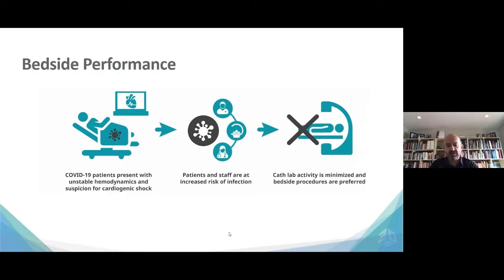And again, those of you who've seen these COVID patients, they're pretty sick. You know, they are on very high ventilator settings. Frequently, they're on dialysis. So again, this brings back this procedure at bedside, which we almost stopped doing, I guess, maybe 15 or 20 years ago. So again, this is a good opportunity to refresh our techniques, how to do it at bedside.